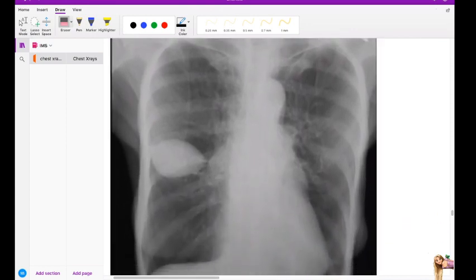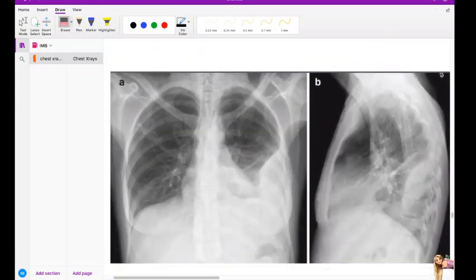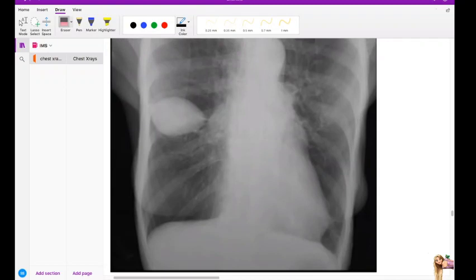Okay. Then this is okay. Yeah. I'll stop after this. It's becoming too long now. I think we'll just do this, okay?